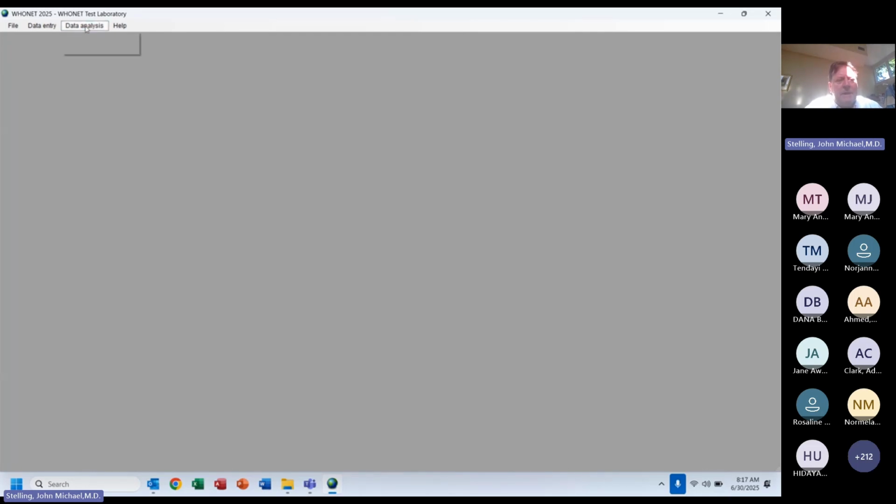I'm going to click here where it says data analysis. 2 options, interactive data analysis where I am in charge. Quick analysis where it's been predefined. Predefined by us in Boston or predefined by you using macros and reports. So I'm going to start with the interactive analyses.